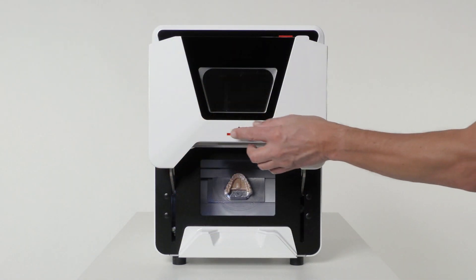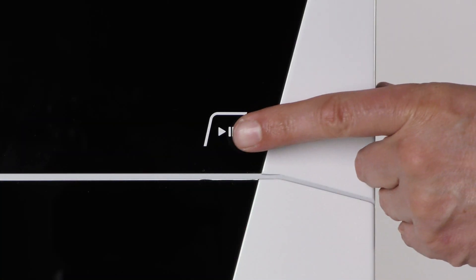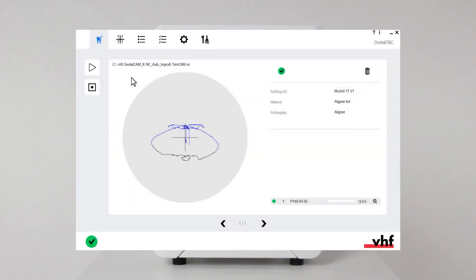When all three points are given, close the working chamber door. Start the job with the start button. Alternatively, start the job via dental CNC.